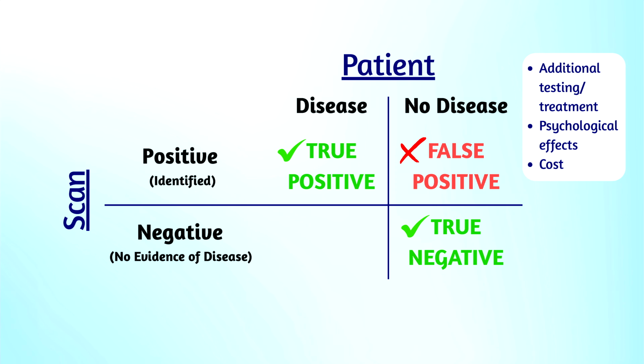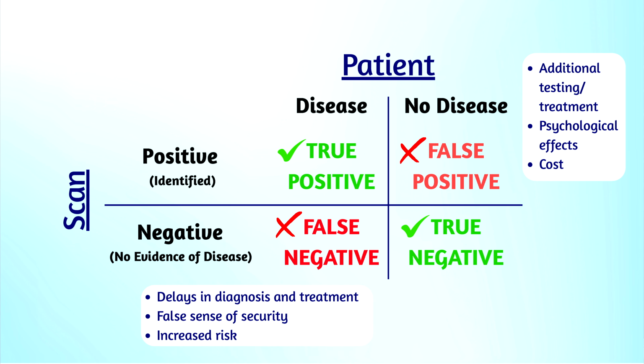But what about false negatives? Where you have the disease, but the scan didn't pick it up. That is the biggest risk in whole body MRI. That's scary. It is. Reassurance. Double negatives, we don't want that. So if you have a false negative, it's just going to delay treatment. It's going to introduce this false sense of security and confirmation bias associated with that, because none of us want to be sick, and the test said I was clear, but in 3 years' time, I'm getting symptoms.